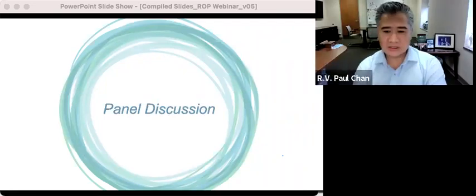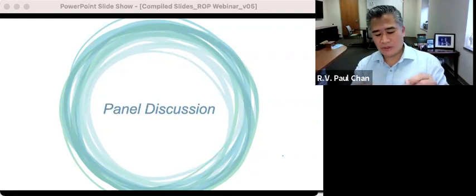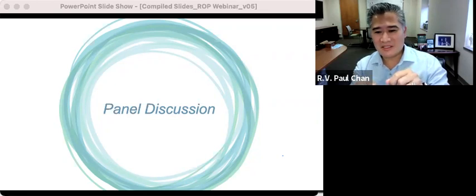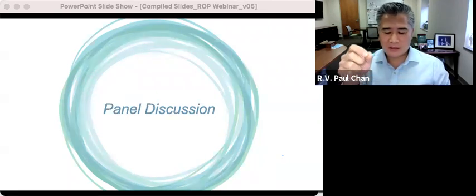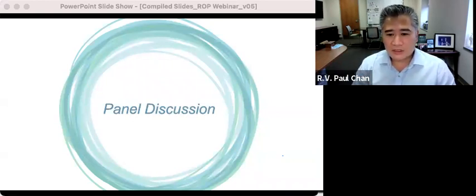Yeah, so this goes into the technical challenges, Claire. Right now we're in a state of clinical validation and streamlining the product. Right now it works with two hands, which, as we know in ROP screening, is not the easiest thing to do. We worked with Pete on this too, just talking through it. We try to create a single device that's just handheld, that's a contact, and then with the illumination on the outside. We've gotten some decent images with that, but that's one of the things that we're trying to streamline.